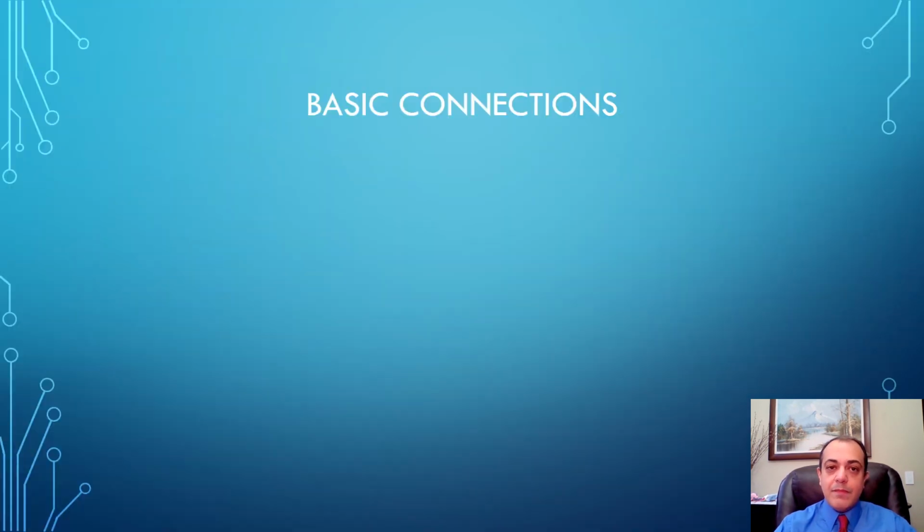I'm going to talk about the basic principles for all of these devices, whether they be sensors, insulin pumps, or even if they make another device in the future that has some application for healthcare, all of them have the same principle. So if you know this, you know how all of them work. First of all, there is the cloud we talked about, and to connect to the cloud, there is a website that the company making the device will provide you with.